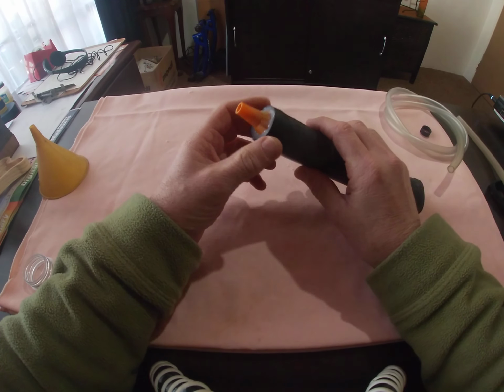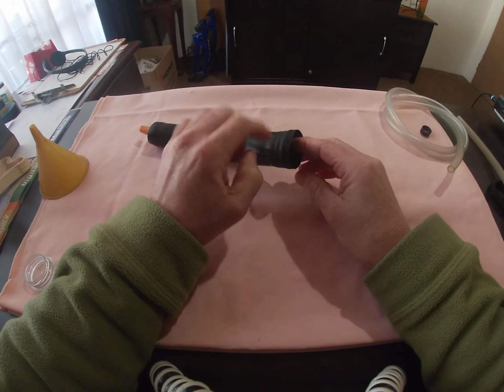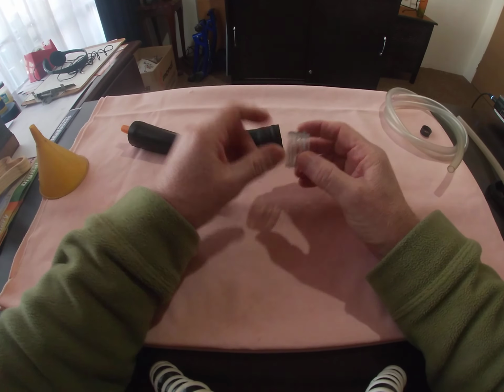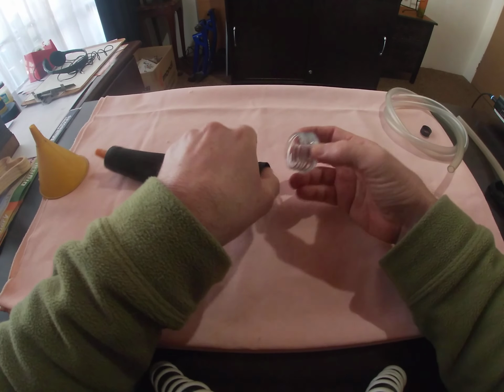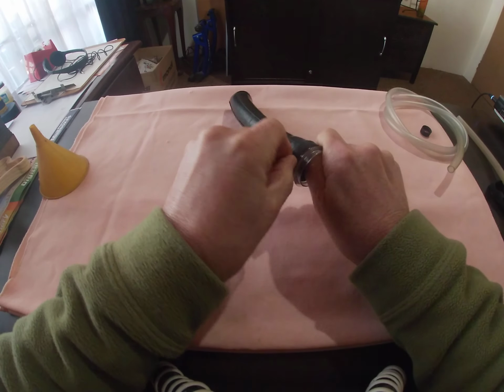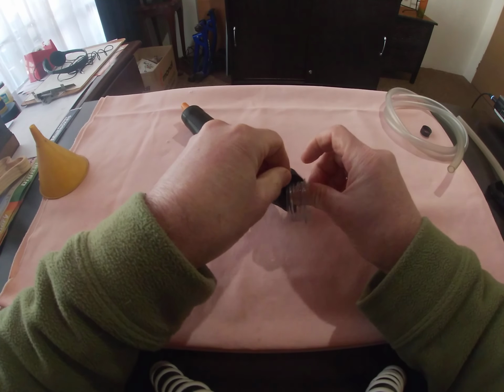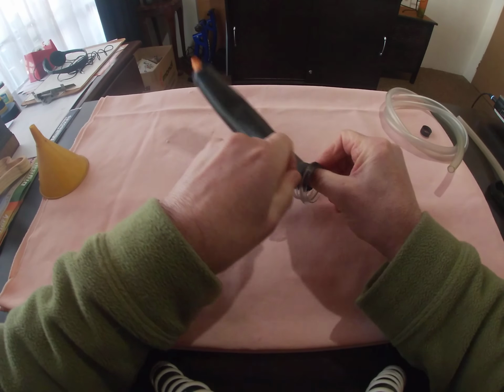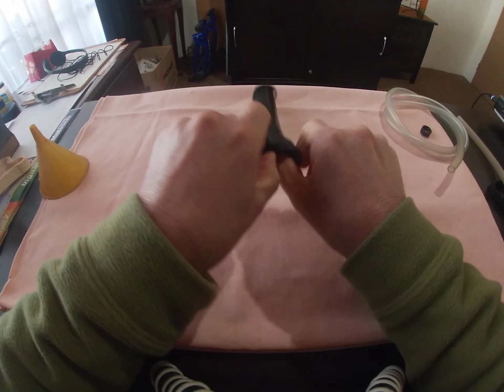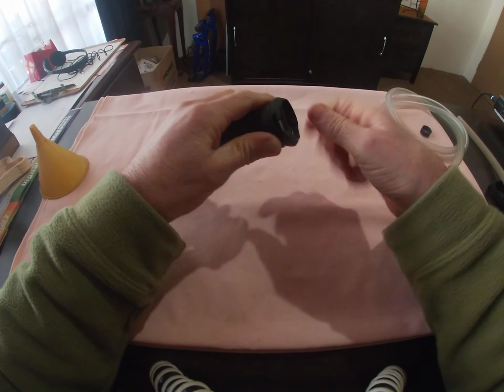Okay, so once this part is in place, leave it to dry. The first time I used it, I had nothing in here, and obviously it's a battle because there's no support, and that's when I came up with this. This will keep the opening, and as you can see here, it should go in tight, and you don't really have to battle it that hard. It will just go in very well. This one is already tight, and that is what you want, but you have to put it in here and make sure it really climbs across the top, and that will make it hook on to the upper part, and that is exactly what you want.